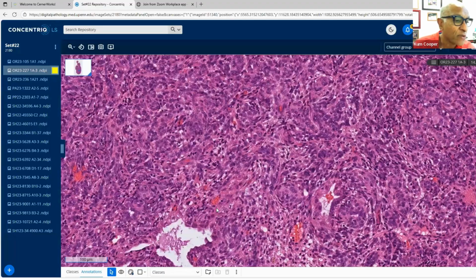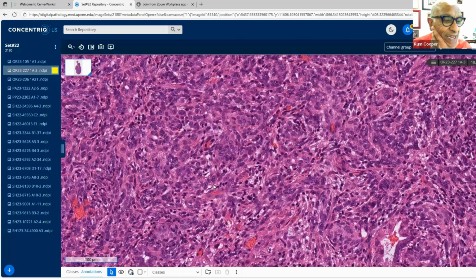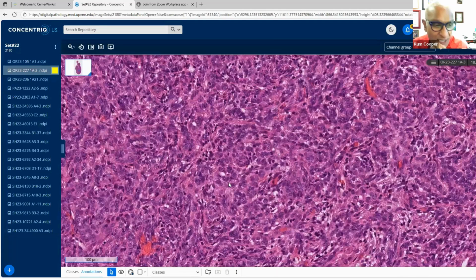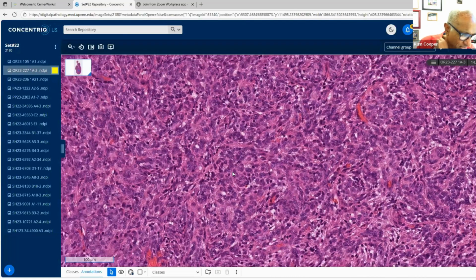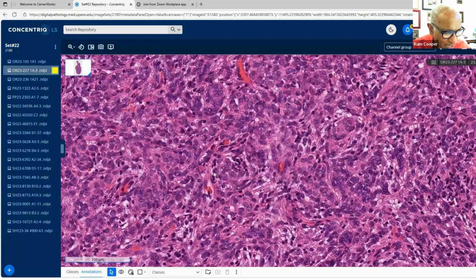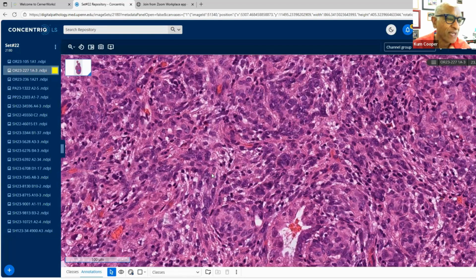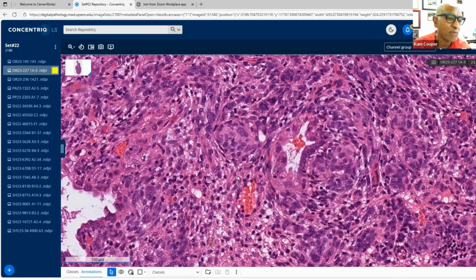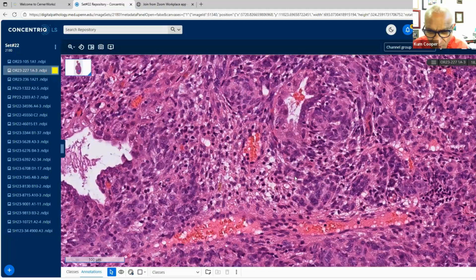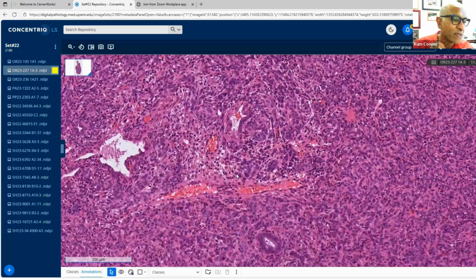And there we go. So we've got a suggestion already in the chat, which is a mesonephric-like carcinoma, and that's a good thought. So this was an endometrial curettage. As you know, mesonephric carcinomas were first described in the cervix. In those days, we used to use CD10 to identify them, and a background of mesonephric hyperplasia. But these days, they've been described in the endometrium, and then they've also been described in the ovary. So hence, it's mesonephric-like carcinoma. Epithelial it is, you're correct. So if you use keratins, these are positive for keratins, just to get that into that differential diagnosis.